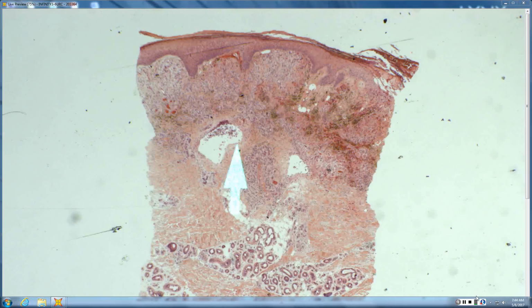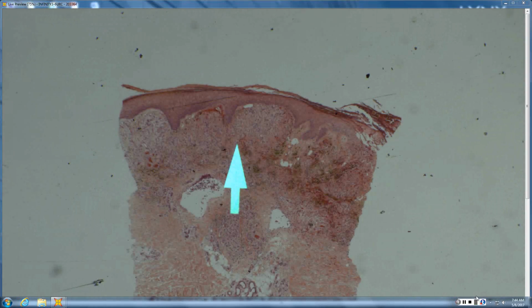Okay. Nice to describe. In the first impression, I can see some hemosiderin and some red cells. There are some enlarged vessels. Very good. In the pattern of the vessels, they're sort of in big round balls. So lots of erythrocyte extravasation, lots of hemosiderin, just as you said.